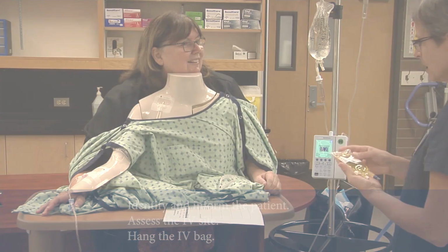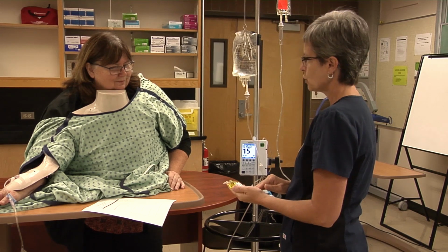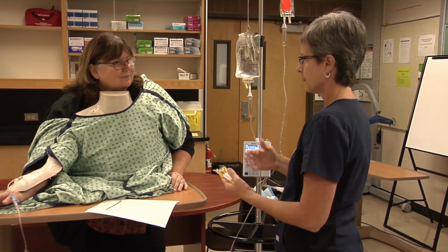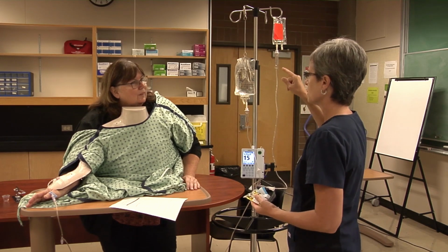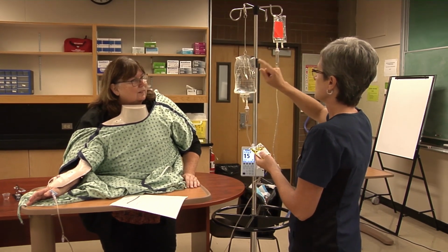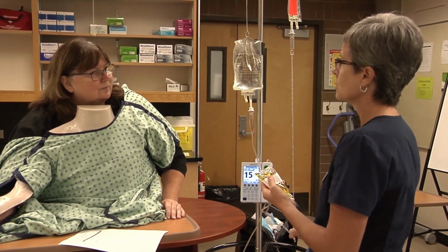So I've looked at the drug monograph. I know that I have to give this drug over 20 minutes. I know that it is incompatible with whatever medication has been hanging in this mini bag previously. So that's one of the first things you need to check. Are you compatible with your primary solution? Sometimes not, usually yes. And then are we compatible with whatever's in this tubing here?